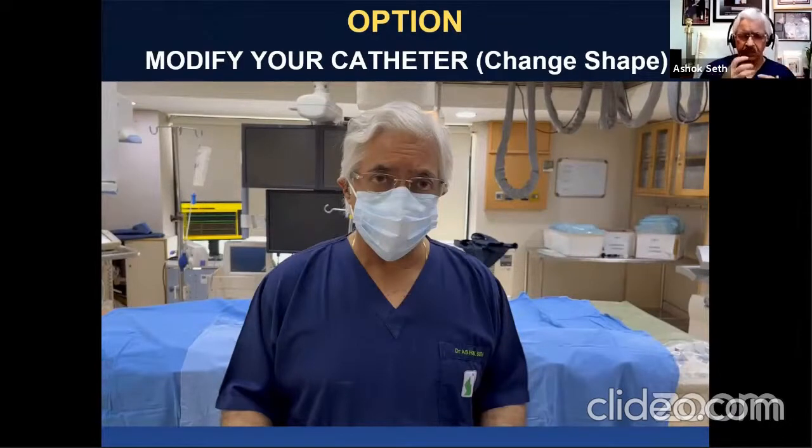We come across not just right coronary artery anomalies, but dilated aortas. We can't reach the left main. We have to make catheters do different things in the variety of anomalies that we actually see. So I'm actually going to show you how I, at least once or twice a year, modify catheters to fit into these anomalous arteries or anatomical variations. So that's what you're going to see now.